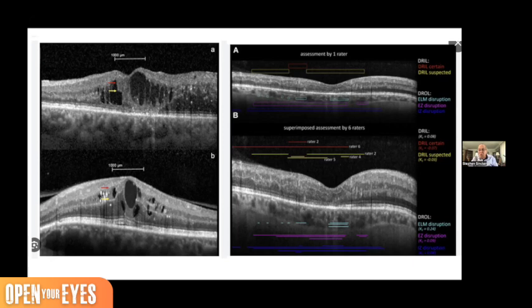And all those little dots that we see in the retina, you know what they are? No, we don't. Are they collections of some sort of exudates leaking from the blood vessels? But we're seeing them over here, so are they leaking from the outer retinal plexus, or are these neuronal, or are these amyloid, or some sort of apoptotic injury products?